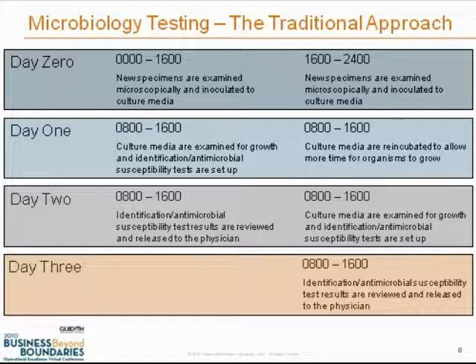Day 2, for the specimens that arrived on day 0 after 4 p.m., now have what was done on day 1 for the other set of specimens, indicating that this group of cultures is 24 hours behind those that were inoculated between 12 midnight and 4 p.m.